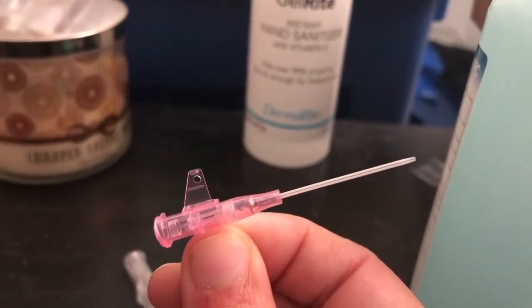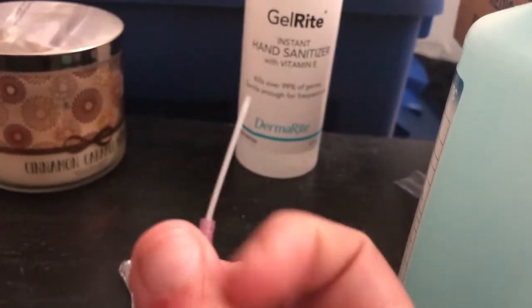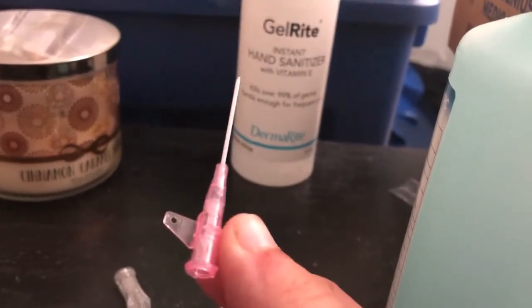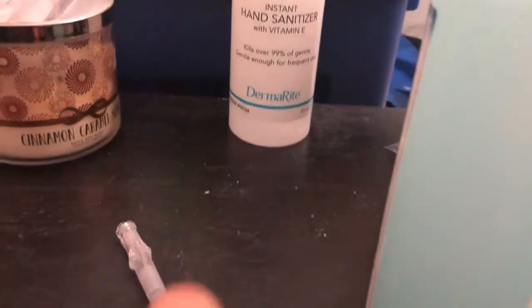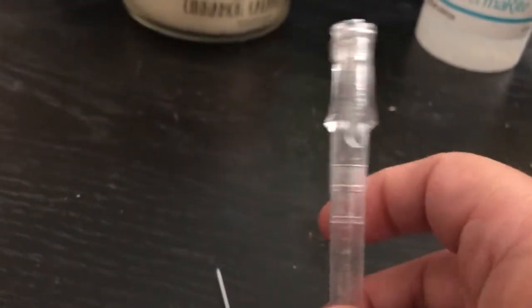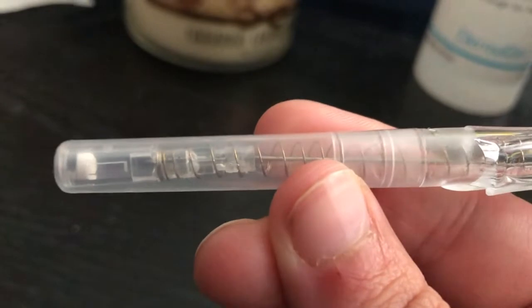And you can see how small it is. But this is just very flexible. See, it's not a needle. I just want to verify that for you guys. It is not a needle. This is a catheter. So this is what's left. But I wanted to show you guys, most of all, that really super great safety feature that those have. And you can see the needle there.